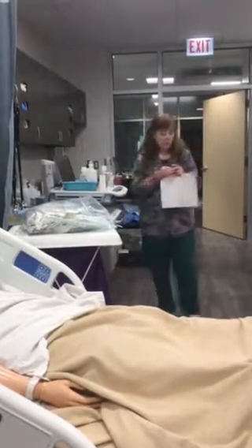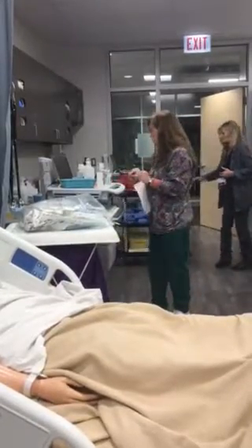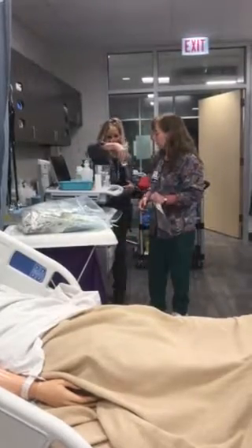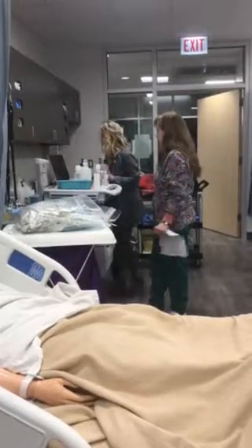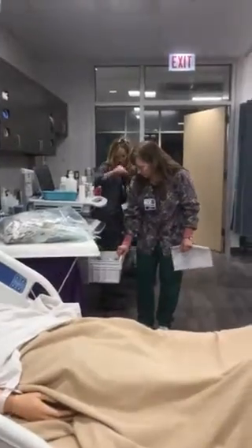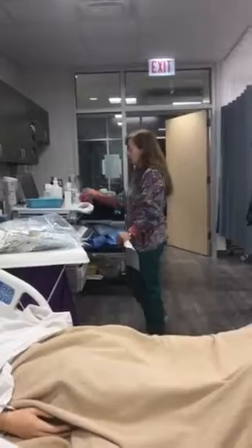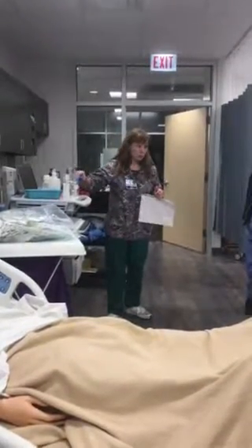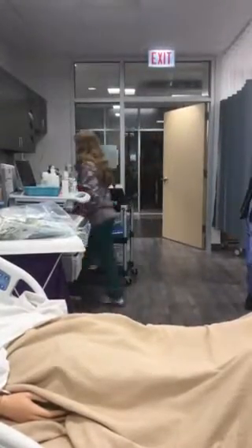So what I would do with this medication is I would crush this, and you guys will get practice at that. Do we have a crusher? Do we have the other one? Oh, I have it in here. I can check those. You want the one like this? Yep, the paper cups. You can use this, not a problem, but you need to make sure that you get all of it out and put it into your cup. I'm looking for the other one. Oh, here it is.